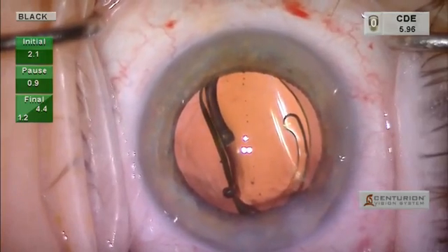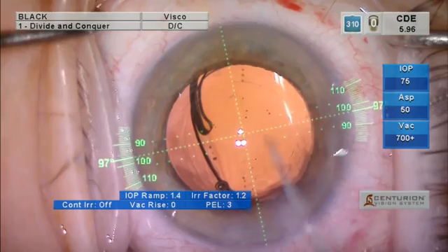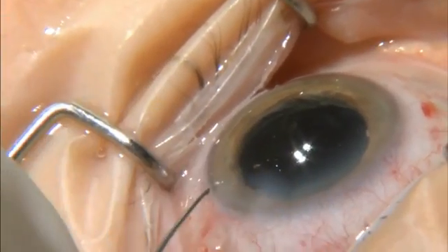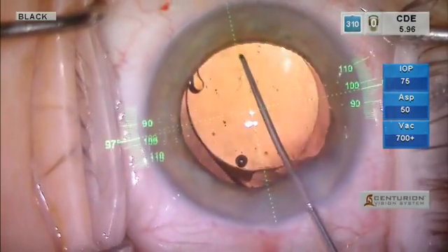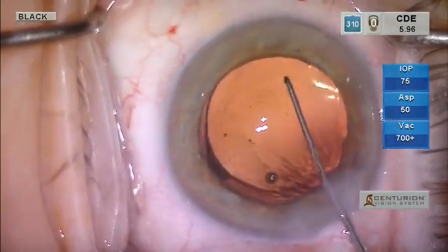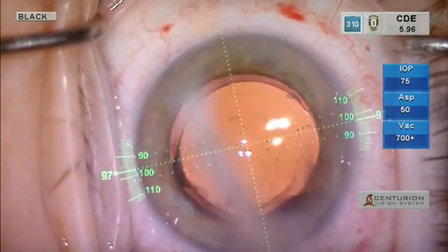We will then switch on the Varion and you can see the intended axis of 97 degrees pointed out. Notice the fact that we do not have any marks on the limbus. There are small areas of subconjunctival hemorrhage from the suction of the femtosecond laser; however, those disappear very quickly and do not seem to be a problem. I rotate the lens to about 10 degrees short of the intended axis with the Sinske hook.